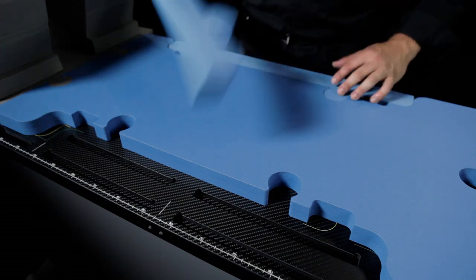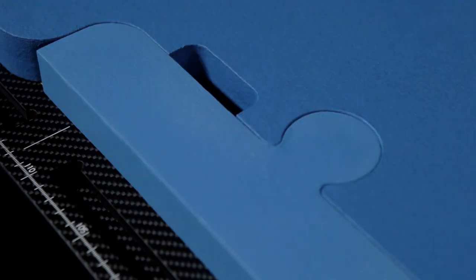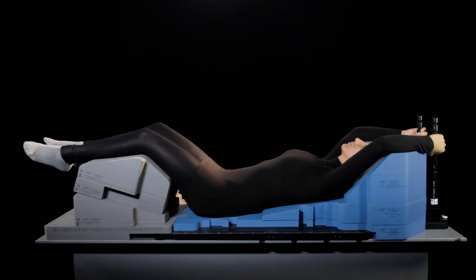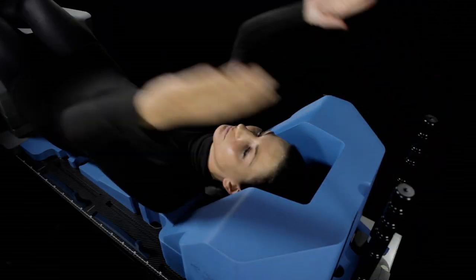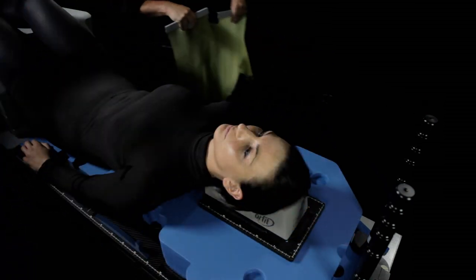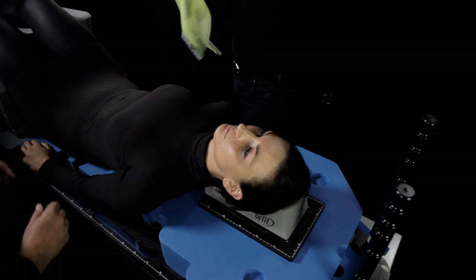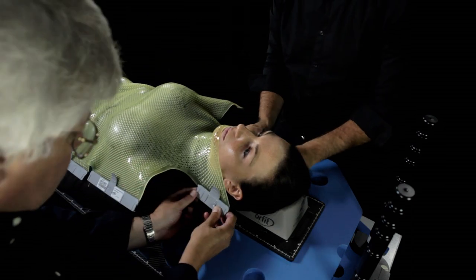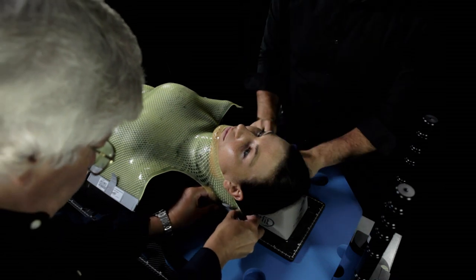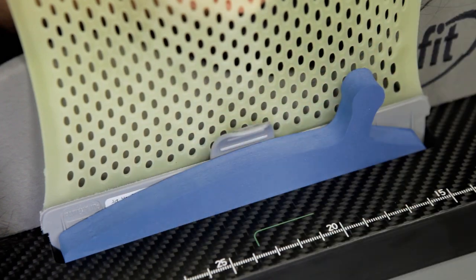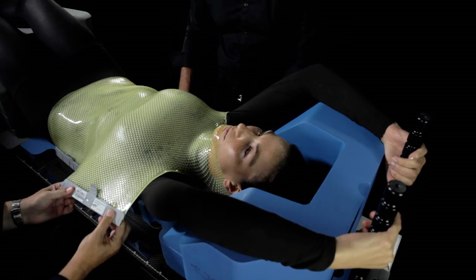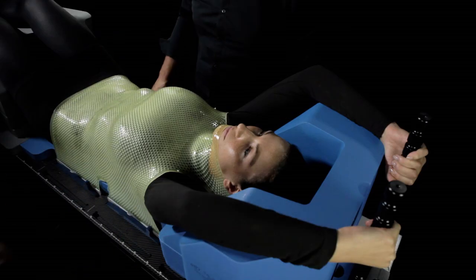The zero angle cushion and the wedges can always be widened using the side pieces if the patient's anatomy requires it. Special thoracic masks can be prepared on the patient to increase the precision of the treatment. To prepare these masks, first ask the patient to put his or her arms down along his or her side and remove the armrest. This makes it easy to access the grooves in the secondary base plate. Place the pre-cut piece so that the upper part covers the chin. Fix the top catches in the grooves of the secondary base plate. Fix them in position using the blue EVA blocks. Put the armrests and the patient's arms back so that the grooves along the body are accessible. Put the other mask clips in the relevant slots and place the long blue EVA blocks. This allows 4-point, 5-point asymmetrical and 6-point thorax masks to be made.